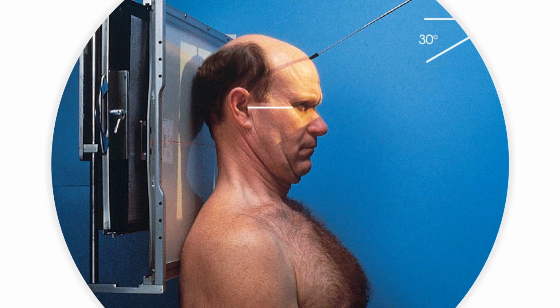Remember when we were learning the topographic lines that there was a 7-degree difference between the OML and the IOML, and so that explains the 7-degree difference in the tube angle between the two projections.